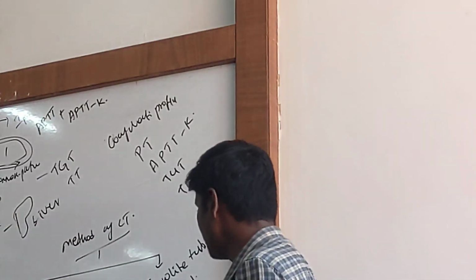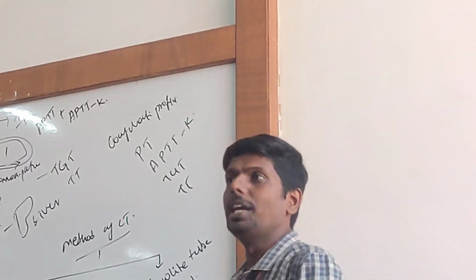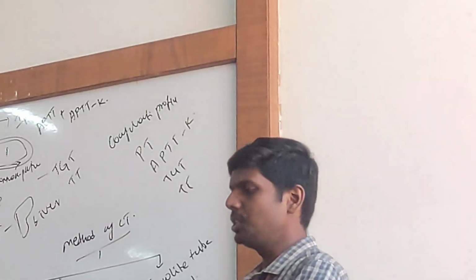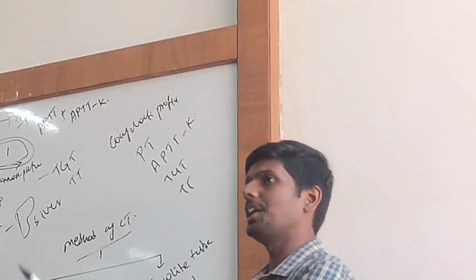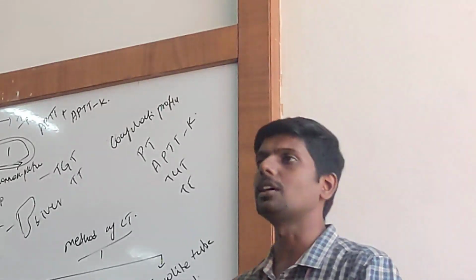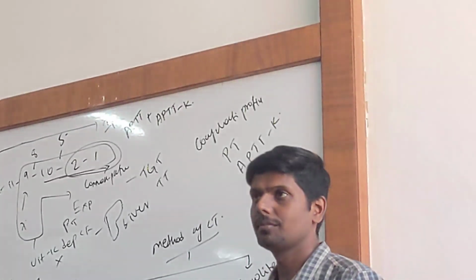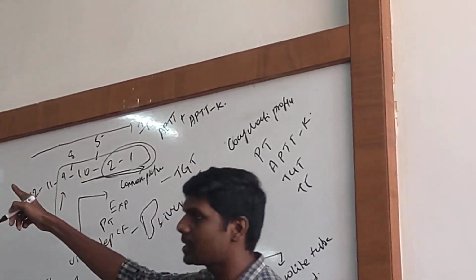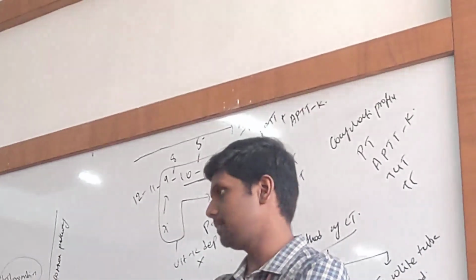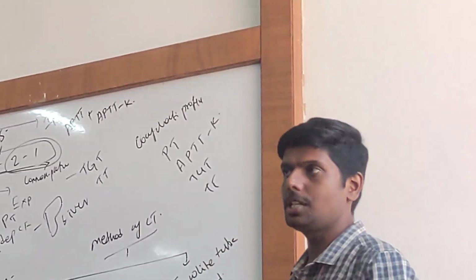At one particular point the blood won't tilt and it will stay like that, it will be locked. Why is it locked? Because it is clotted. It's no more tilting. Once you are not seeing that movement of blood, that indicates it's clotted. So this is the gold standard test to get an accurate clotting time. But the most commonly used test is this one. Same like our bleeding time, most commonly used is finger prick, but ideally the IVY method is the correct method. Got it? So that's it. This is all about clotting time estimation.